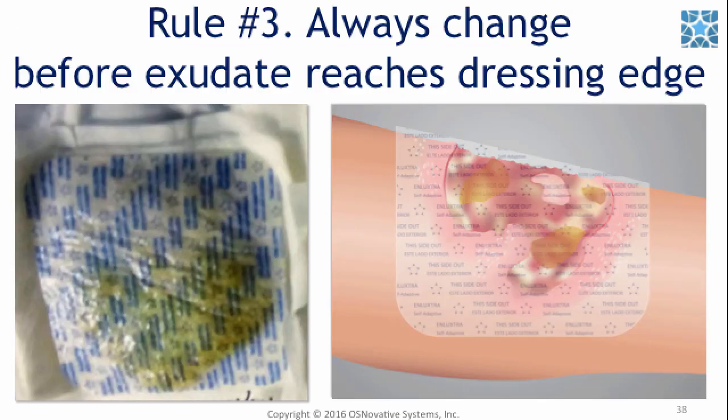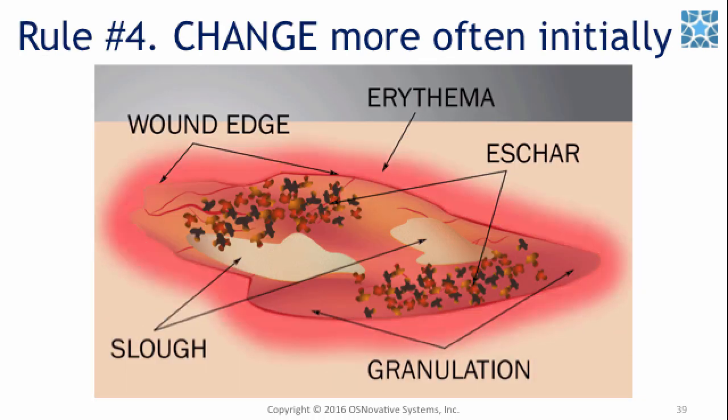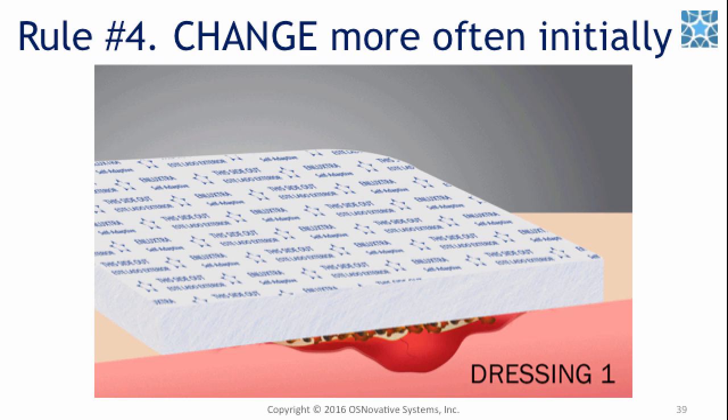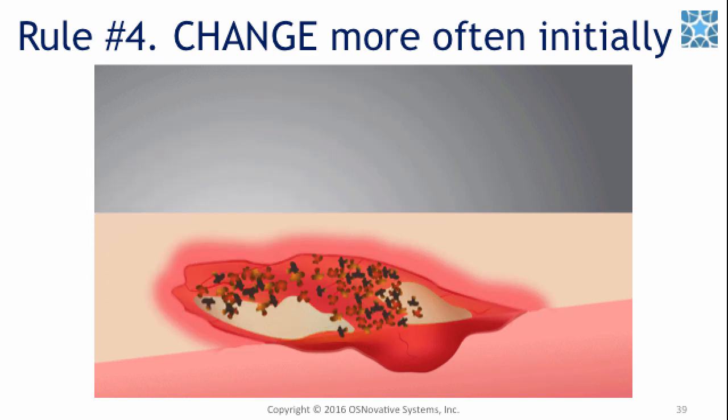Rule 3. Always change Enluxtra before the exudate reaches the dressing edge. Rule 4. Change more often initially. Enluxtra is designed to stay on a wound for up to 7 to 10 days.